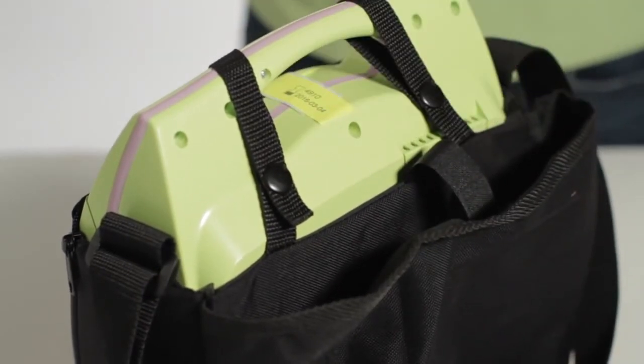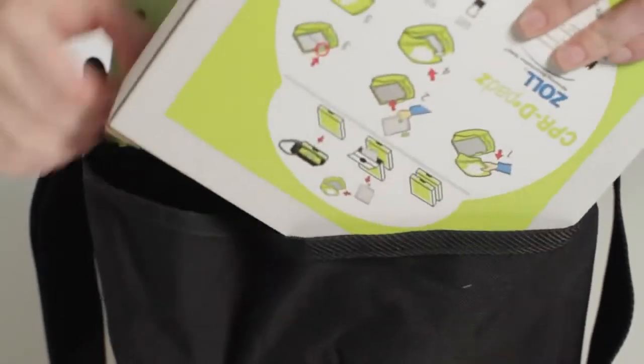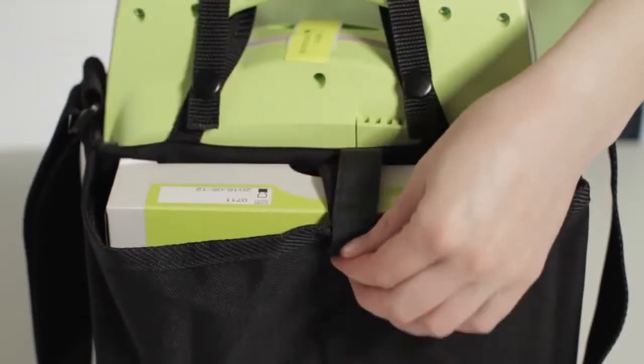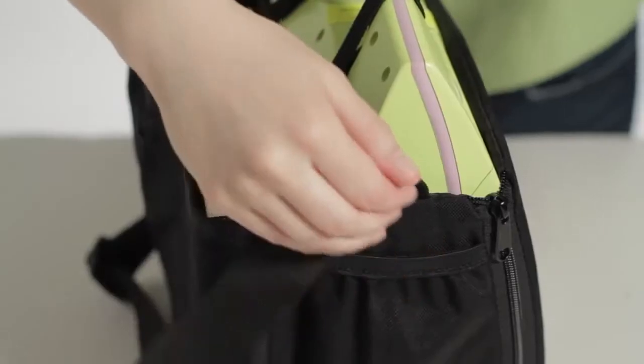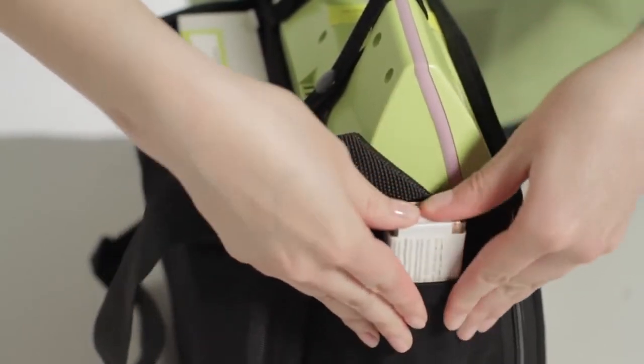This case can be used to store backup pads and batteries along with the AED. A backup CPRD pad can be inserted into this reinforced pocket with the expiration date label exposed. Connect the Velcro retaining straps to keep the pad securely in the pocket. A backup sleeve of batteries can be inserted into this pocket on the side of the carrying case.